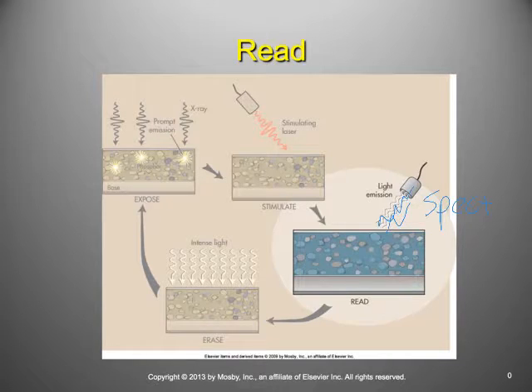So I said it's a very specific red light, and then a spectrum of blue is emitted by the europium as it goes from a metastable state to a stable state. And there's a really important illustration of this on the top of page 288. There's an illustration of this kind of spectrum, a discrete laser, and then a continuous spectrum of blue light.